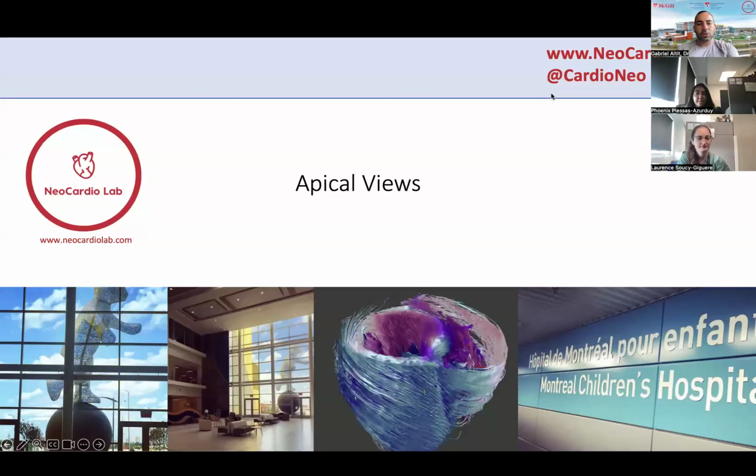Okay, welcome. I'll be doing now the apical views and subcostal views. So we're going to try to review this.